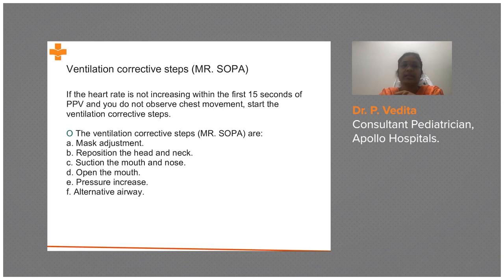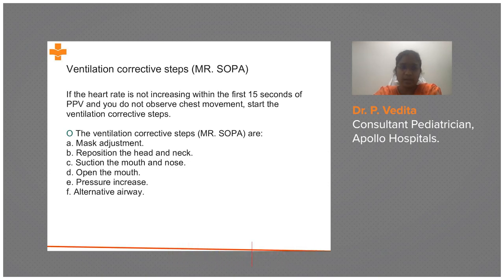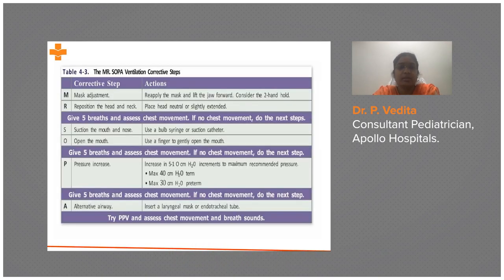These two, see, each step, two at a time. Do mask adjustment, then reposition the head and neck, and then again do bag and mask. If it has not increased, then again suction the mouth and nose, open the mouth, and then again do bag and mask. If again it is not increasing, then next is pressure increase. And the last one is alternative airway: endotracheal intubation or the laryngeal mask airway. So, MR SOPA.